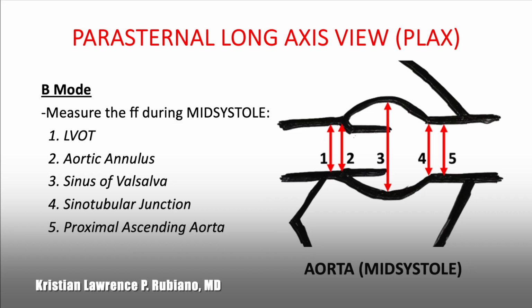LVOT is a segment of the left ventricular outflow tract that extends from the left ventricle to the aortic valve and is situated just below the aortic valve annulus. Next is to measure the aortic annulus. It is a fibrous ring that forms the base of the aortic valve and connects the valve leaflets to the left ventricle. It is located just below the aortic valve leaflets. Be sure to get the measurement at the maximal aortic valve opening in mid-systole.